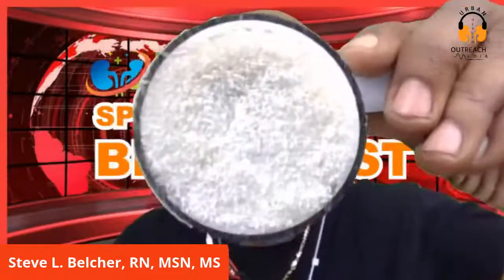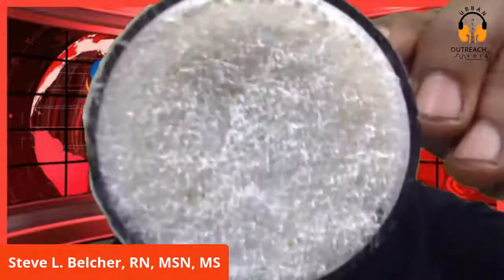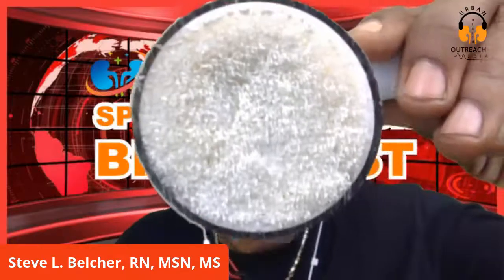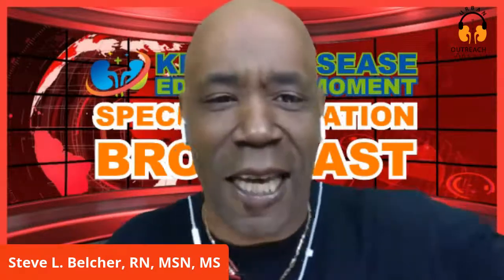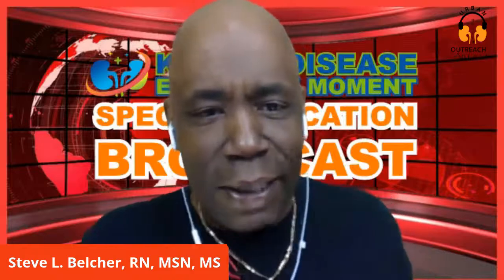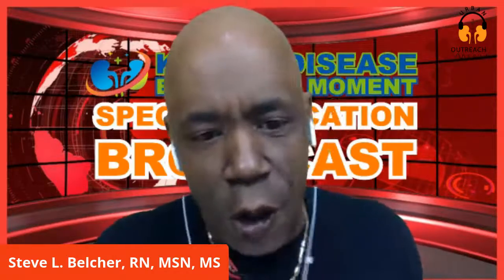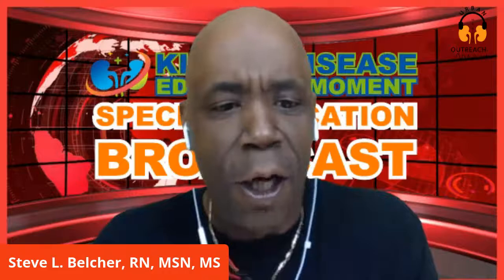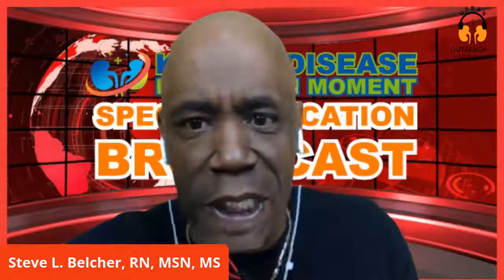Each time your blood hits the dialyzer, this is what it's going through - those are the fibers inside the filter. How many of your units or clinics educated you on that? The dialysis machine also keeps track of blood flow and blood pressure, and measures how much extra fluid is removed from your body.